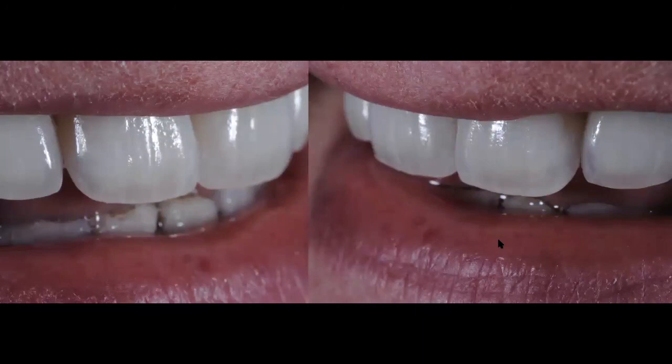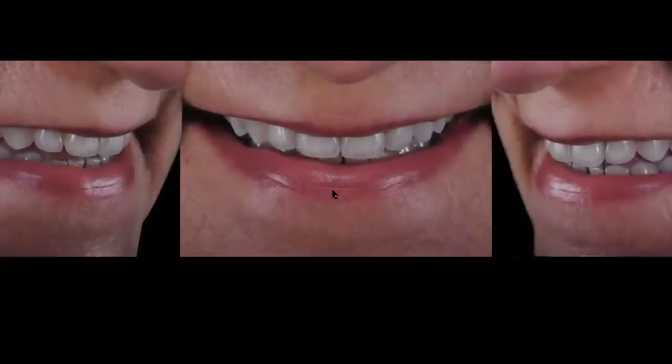All I did for this patient was prep those teeth, make a nice impression, give a lot of information to the lab. That's my work. But then you have another person doing the rest, which is your lab technician. And in this case, and in all the cases that I've shared with you, I give them all the credit, because they are truly the artists behind the ceramic work that you're seeing. But I want you to look at the canine and the craze lines and the gray. And I want you to look at the lateral and the centrals on both sides. Look at the craze lines here. So he was able to reproduce that on the veneers, because I wanted to recreate dentition. And that's what my patient wanted as well.